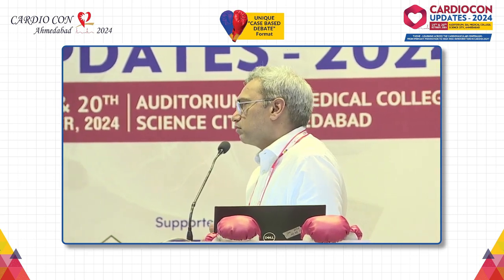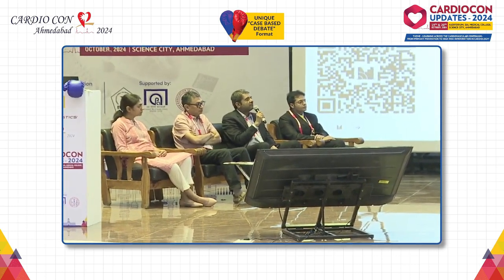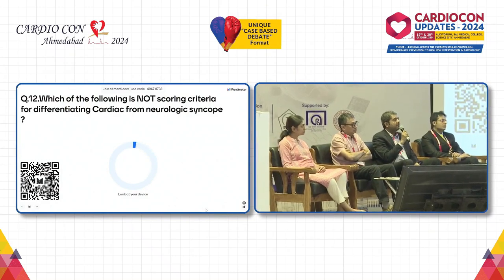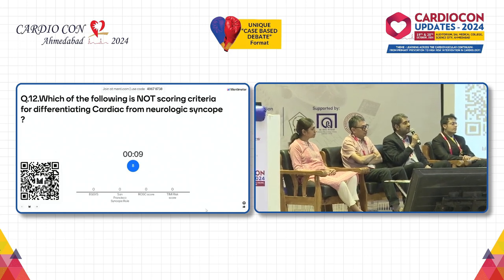Just one last point I wanted to make: considering putting an ICD as an option, if the patient has recurrent episodes of cardiogenic syncope and probably scar VT as the etiology, then are we in a soup? The ICD may be repeatedly firing and giving shocks, and we have not done substrate mapping. That is what I just wanted to convey.